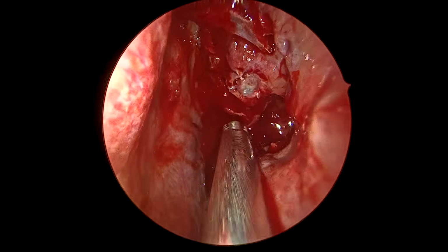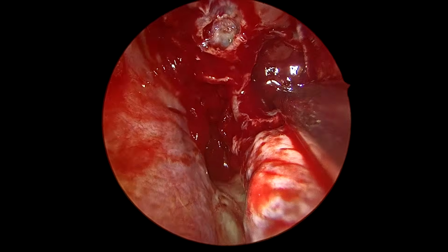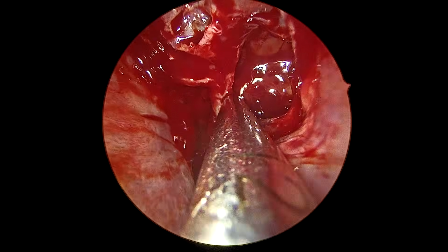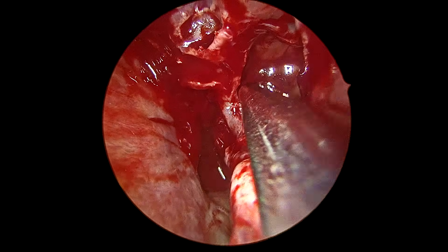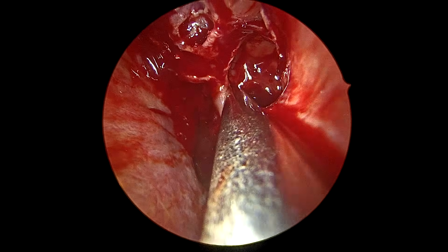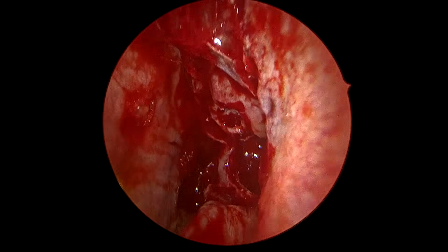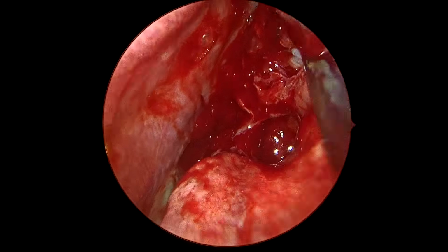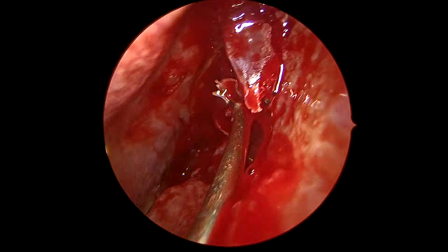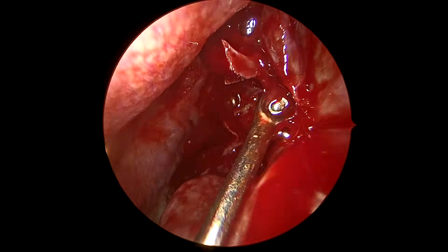This is the bulla ethmoidalis. So I decided to do one step further in this case, considering I was treating this mass as a benign tumor and expecting a recurrence, as in cases of tumors. I was doing one step extra for this patient. So I wanted to do an anterior ethmoidectomy also, which I'm doing right now. This is the anterior part of the bulla, which I am removing.